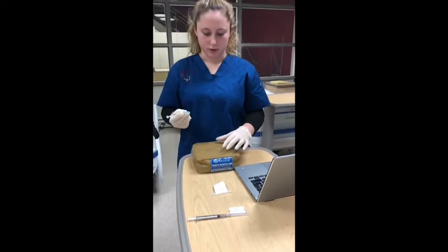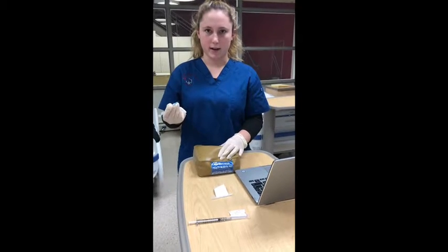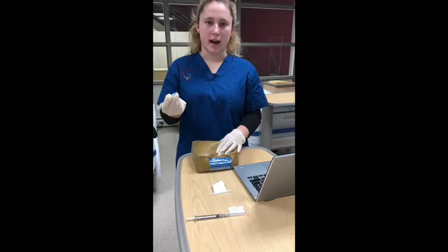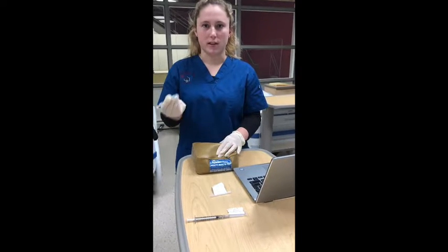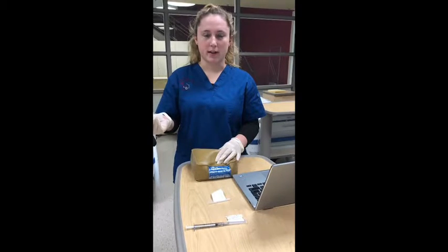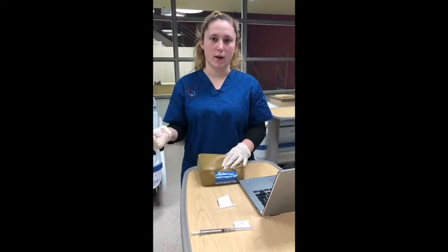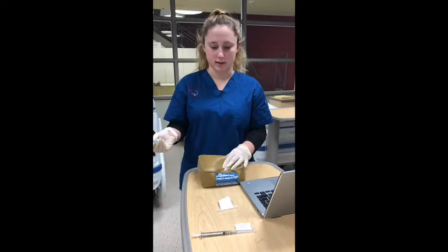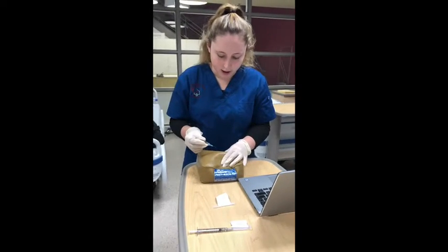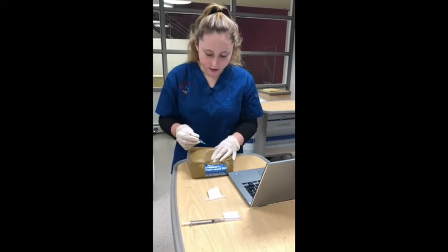And then I'm going to squeeze with my non-dominant hand while I'm holding the needle in my dominant hand. And I'm going to go in at a 45-degree angle for the subcutaneous injection, because Mr. Mancini is smaller, but if he did have more adipose tissue, then I could also go in at a 90-degree angle for a subcutaneous. So I'm gonna pinch the skin, and I'm gonna go in at a 45-degree angle.